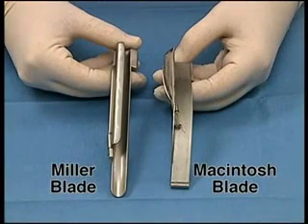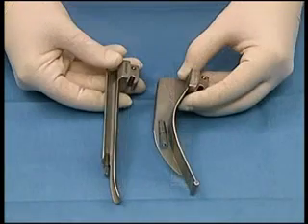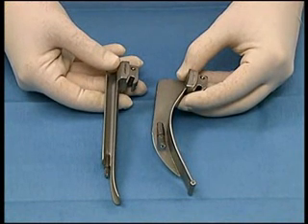Miller blade and Macintosh blades are available for use with a laryngoscope. The Miller blade is more useful, as it is long and narrow and should be placed over top of the epiglottis. The Macintosh blade is broad and round and should be placed beneath the epiglottis, and the epiglottis should be pulled down.